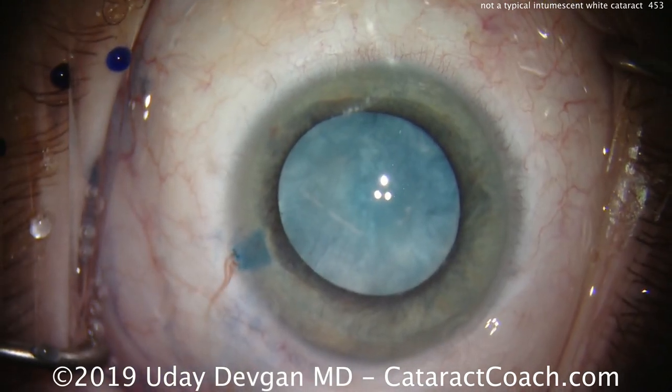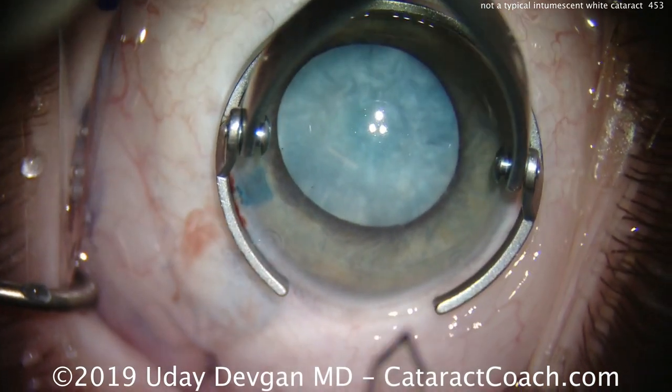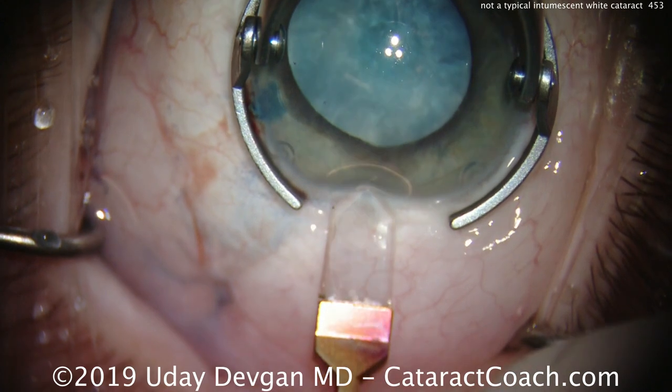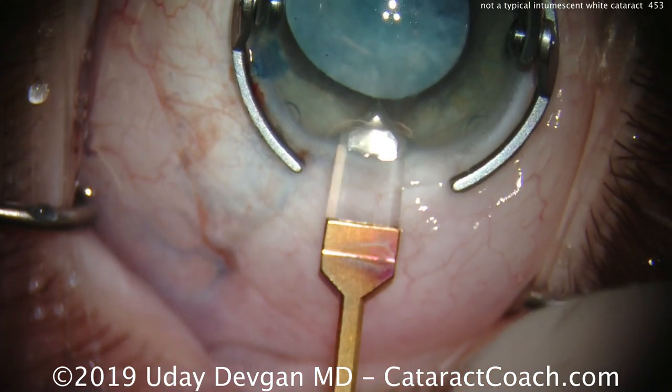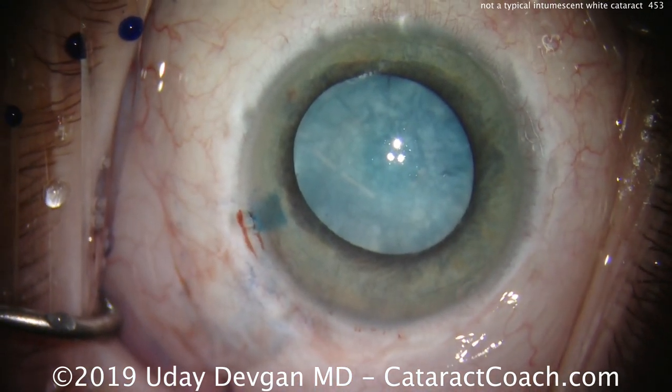Normally in an intumescent white cataract, we would do the technique of the double rhexis or some other way to decompress and alleviate the pressure from the capsular bag, and we do that before making the main incision. So why am I making the main incision now? Well, because this case is very different.